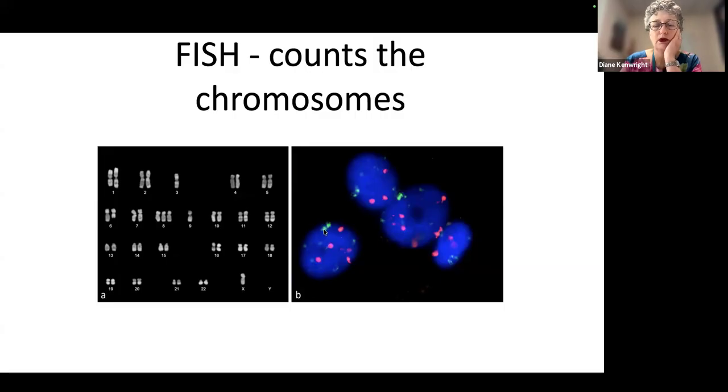And we've got 2 blobs of green. So if this is, for example, 8, we might have 4 copies of 8 and 2 copies of 3. And we look at the ratio between them because this could be a cell that is like 2 cells together or has doubled its chromosomes. So here, for example, we've got lots of 8 and 2 copies of 3. And the same here. And they look at lots of these cells.